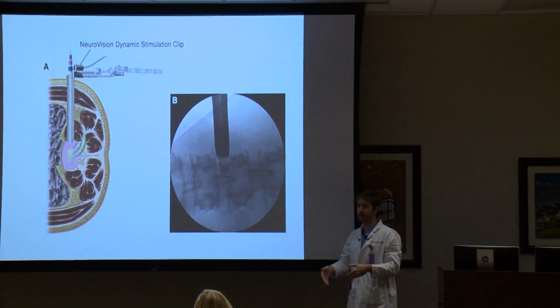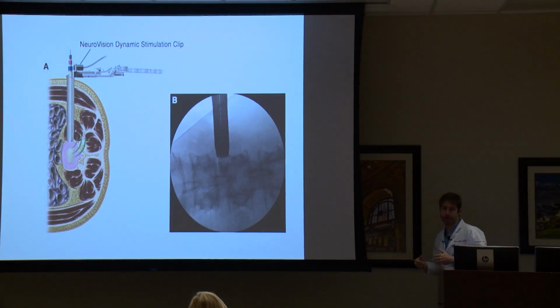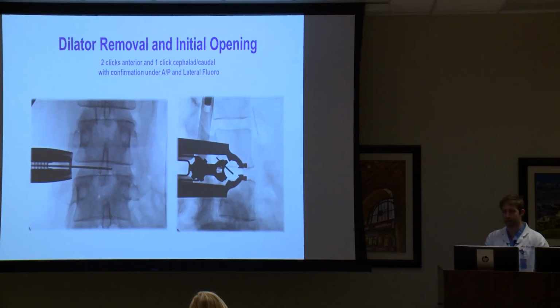Now I'm looking straight down at the disc space. That's a nice thing when it works. A lot of times you'll get a little muscle creep, and you'll just have to move that out of the way, or potentially just burn it out of the way. But here's the picture from straight on.